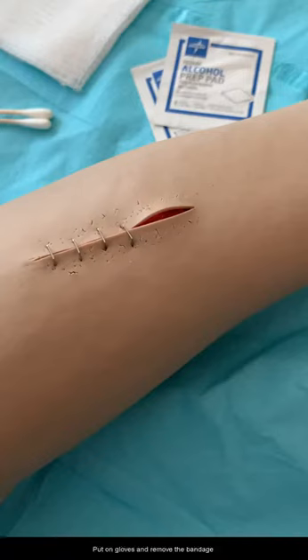Put on gloves and remove the bandage. Clean the incision per the provider's guidelines.